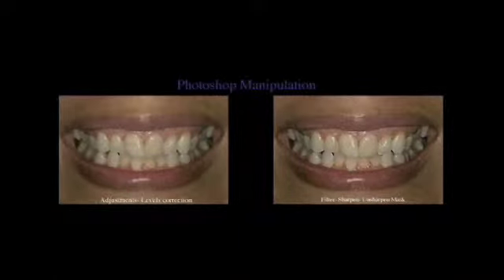So if you look at the difference between here and here, this looks a little soft, okay? Looks a little soft, and in fact, probably hard for you to tell. Like right now, she has a little bit of peach fuzz, if I can say that, this patient here, and it's not easy to see, which maybe is a little kinder for the patient. And now, as you unsharp mask it, the peach fuzz becomes a little more obvious.